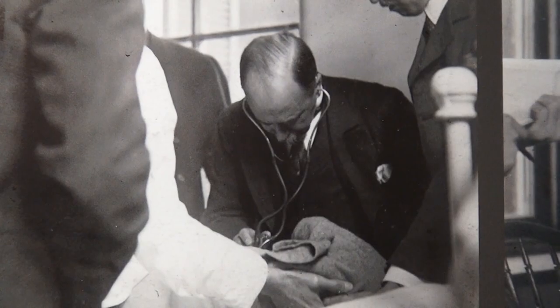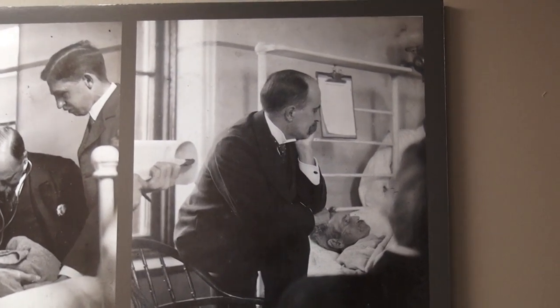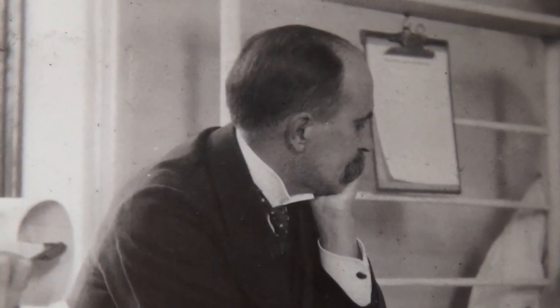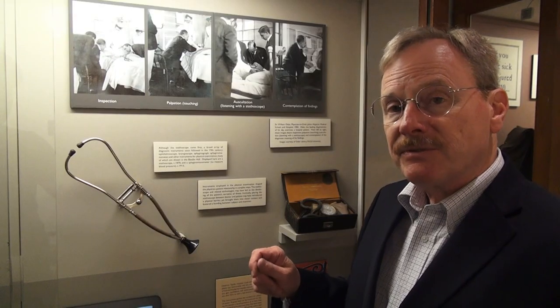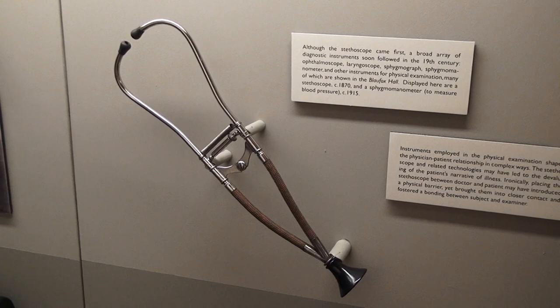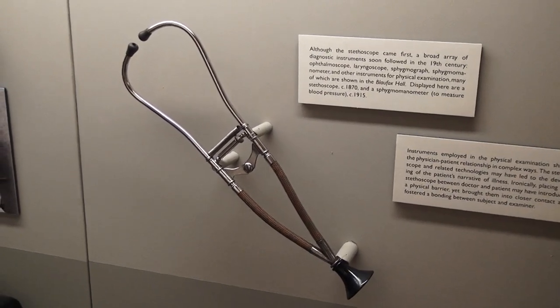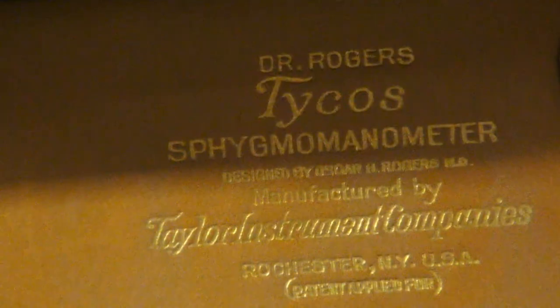Finally, he contemplates what he has learned from the examination. The instruments really bring together physician and patient in close physical approximation. Some of the basic instruments for diagnosis in 1900 would have included a binaural stethoscope, and by about 1910, blood pressure measurement, otherwise known as a sphygmomanometer.